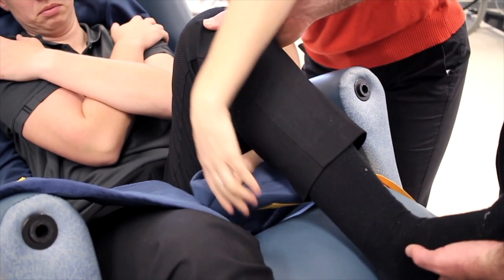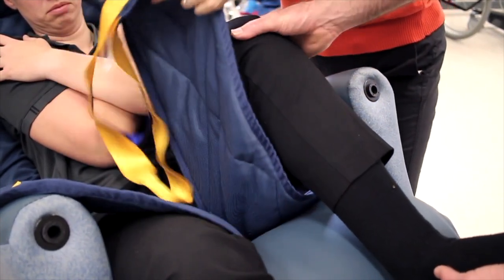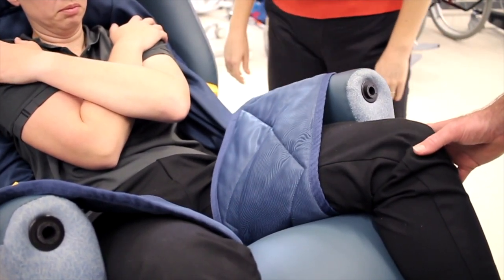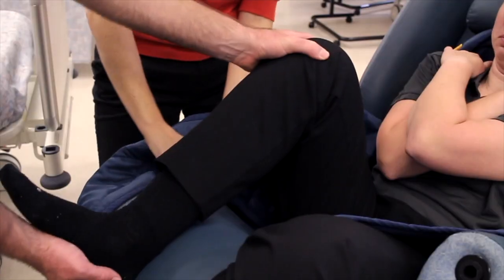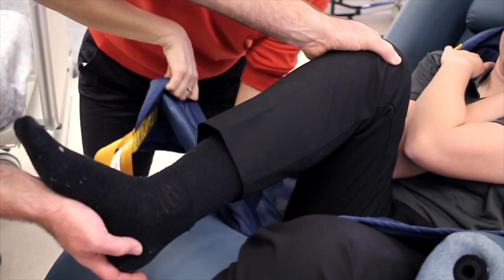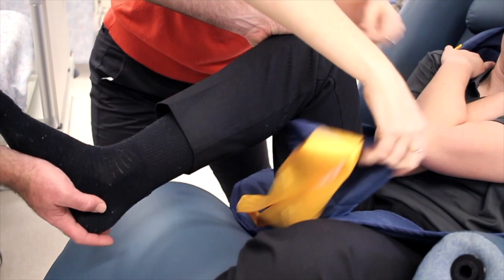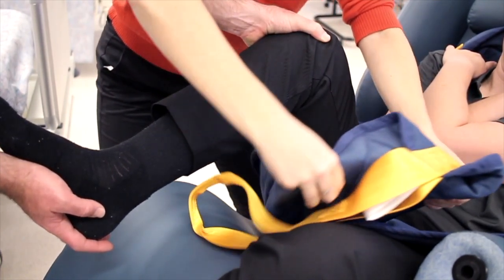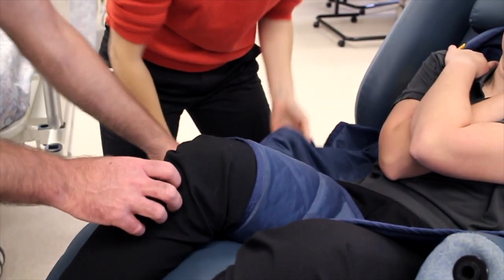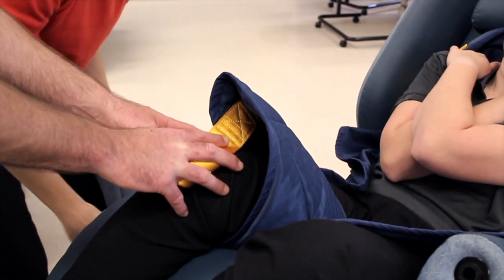For clients or consumers that fill out the chair, where it's difficult to get your hand down the lateral or outside side of the thigh, there's the ability on some chairs to remove or manoeuvre the armrest down. This can be seen on this side where our therapist has taken the side of the regency chair down, which provides easy access to position the leg strap underneath the thigh. The straps are then taken out of the road and the armrest is elevated back into position for safety during transfer.